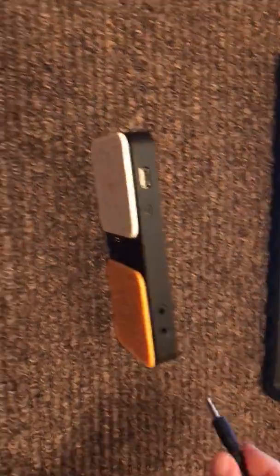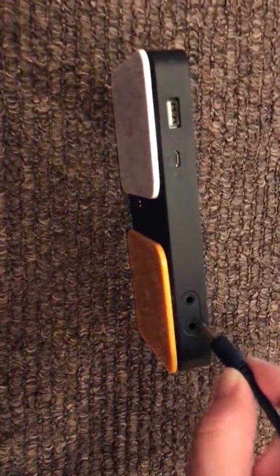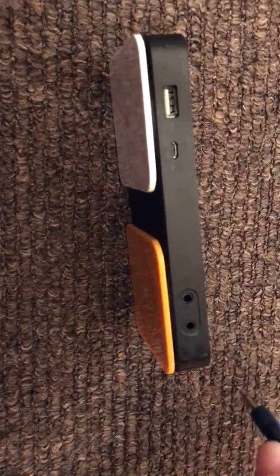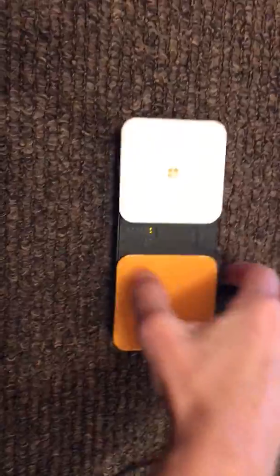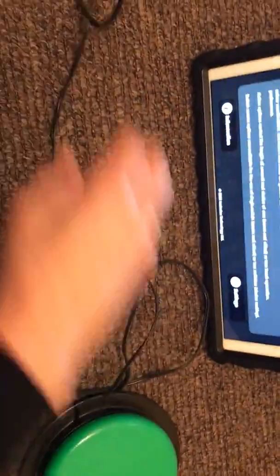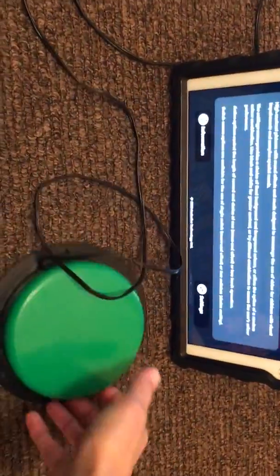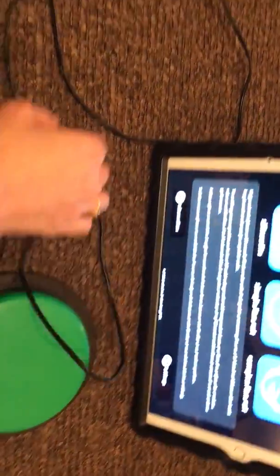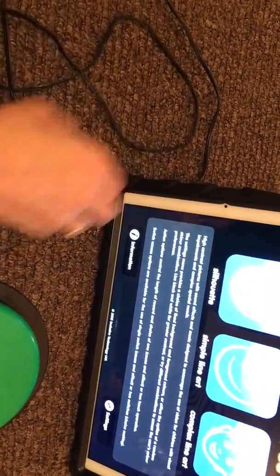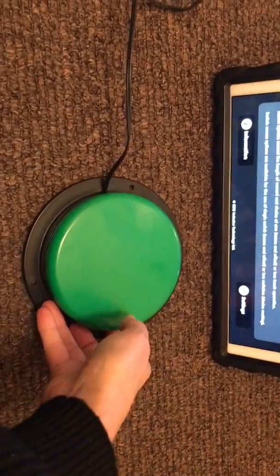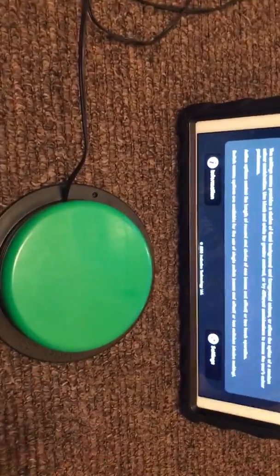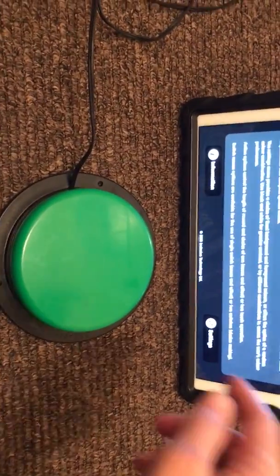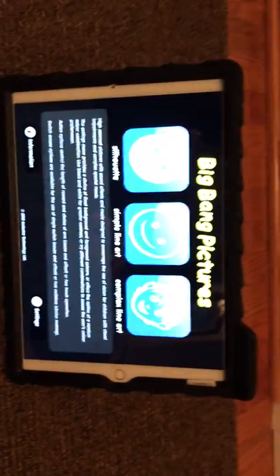Make sure it's in slot one. Then you can move the Bluetooth out of the way and just use your regular jelly bean switch or your toggle switch or any other type of switch that you'd like to use. We're going to be able to activate our Big Bang Pictures app with this switch, so go ahead.